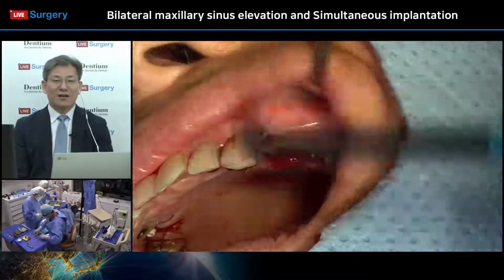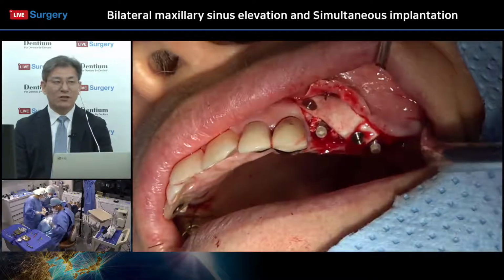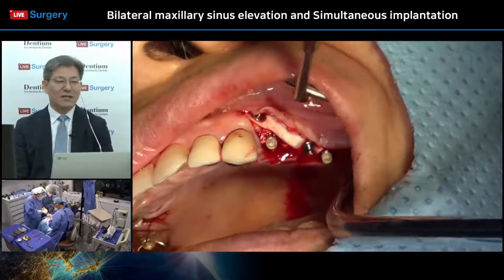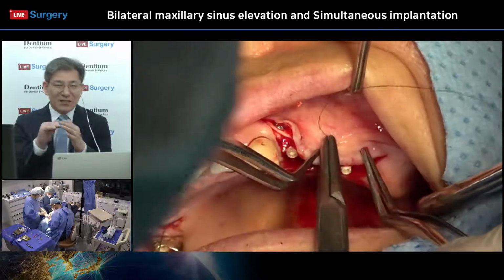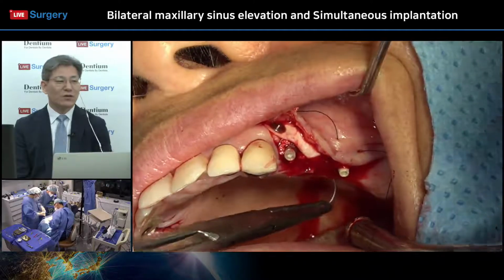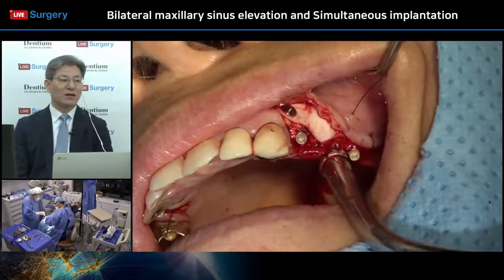Sometimes the blade is dangerous, as you know. While cutting the periosteum, sometimes it cuts the overlying flap and causes penetration of the overlying flap, so it is very difficult to manage when you suture. So if you choose the blade for the releasing incision, you always have to be cautious and gentle in cutting the periosteum from the overlying flap. I recommend for this releasing incision a periosteal curette or some blunt instrument instead of the sharp scalpel, right?